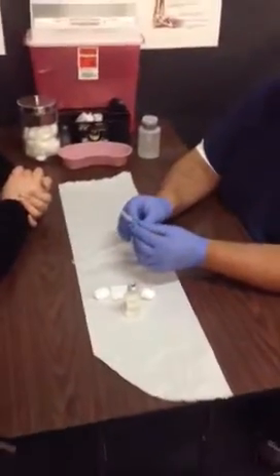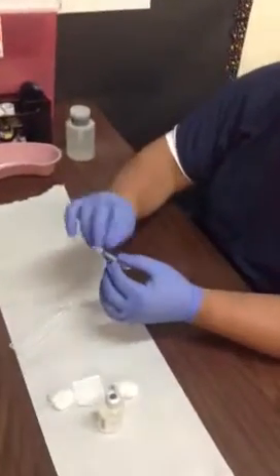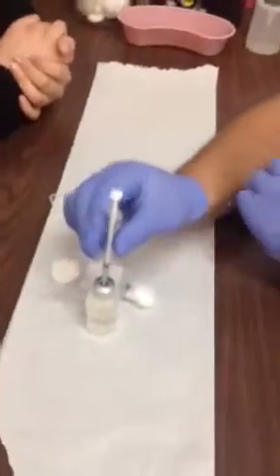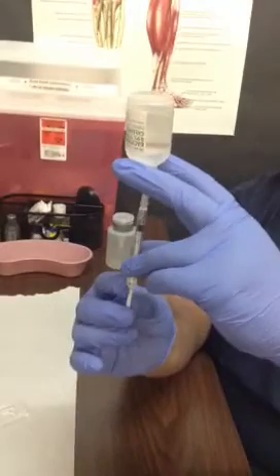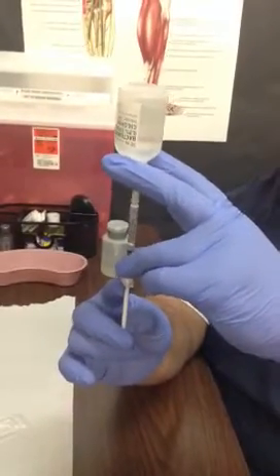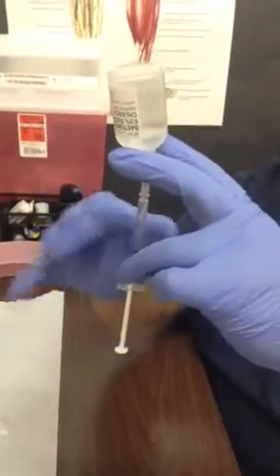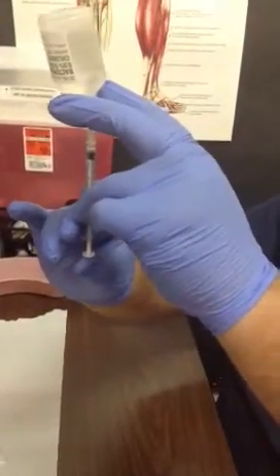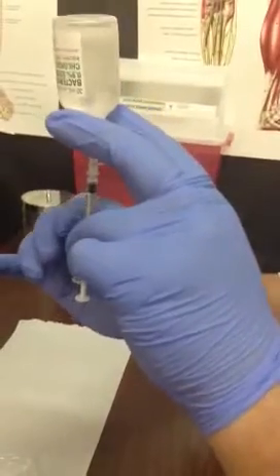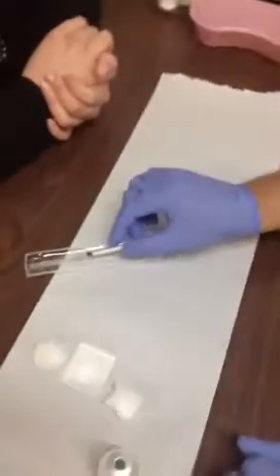We're going to use a 0.05 cc dose, so we're going to draw the plunger up to 0.05 and withdraw the medication. Using one hand, place the needle into the vial stopper, turn it upside down, inject the air — you'll see the air bubbles go in — then withdraw the medication. Withdraw a healthy amount; if you go over 0.5, that's plenty to get those bubbles to the top. Return the plunger to the 0.05 mark — five little lines past the first big one — then safely set it down, pull the needle out, and recap it with the single-hand recapping technique.